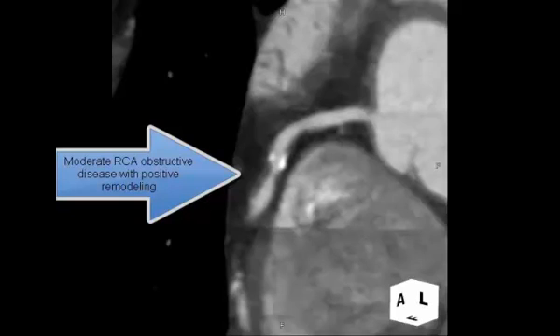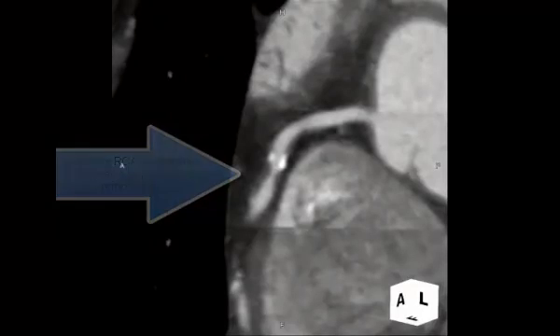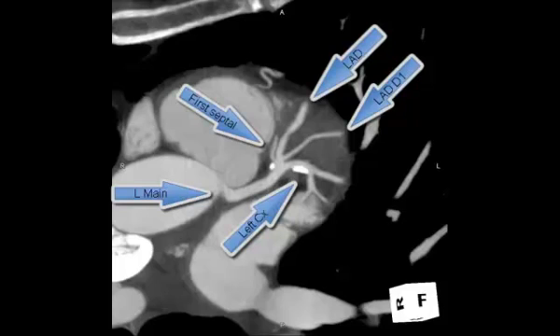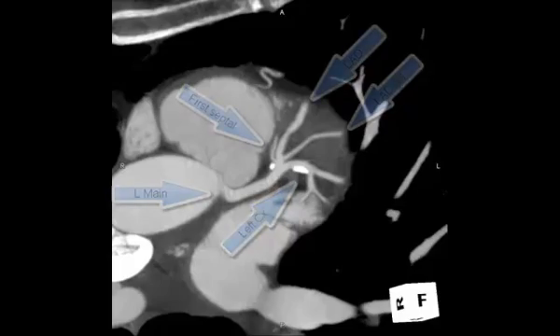Here is an NPR which has been done, and you can see a little bit of distal remodeling which has taken place after the calcified portion of this plaque. Here is a long axis view which highlights all the other additional vessels which are nicely shown.